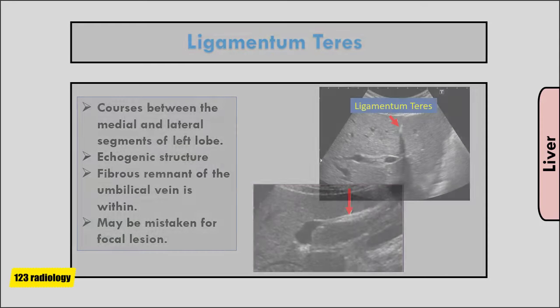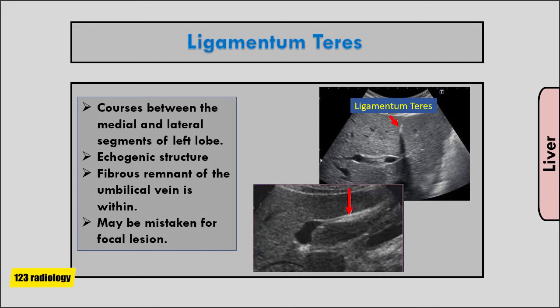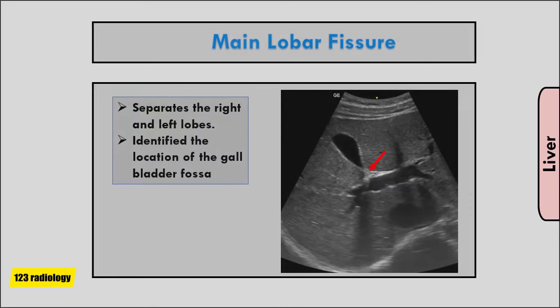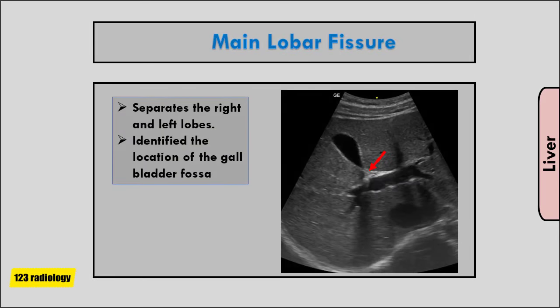The ligamentum teres is an important landmark to identify, and it courses between the medial and lateral segments of the left lobe, appearing as an echogenic structure. The fibrous remnant of the umbilical vein is within this ligament, and it may be mistaken for a focal lesion. The main lobar fissure separates the right and left lobes, but more importantly it identifies the location of the gallbladder fossa.